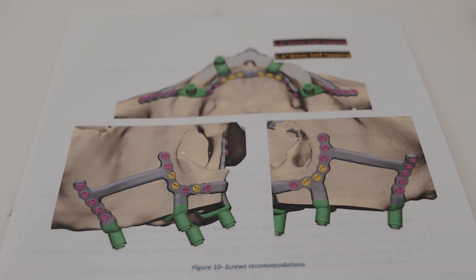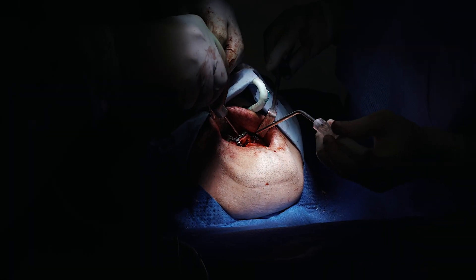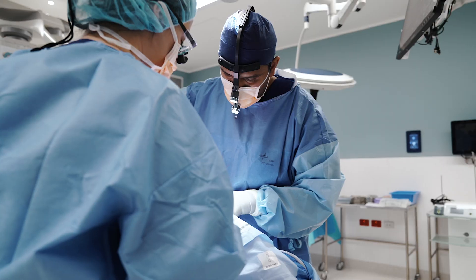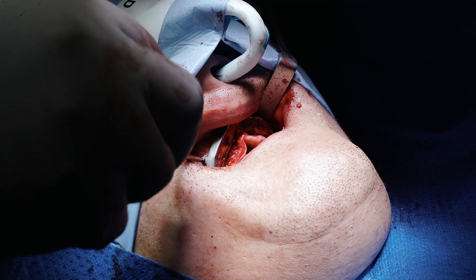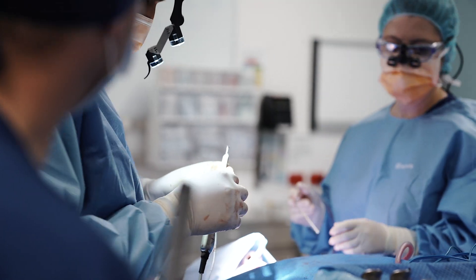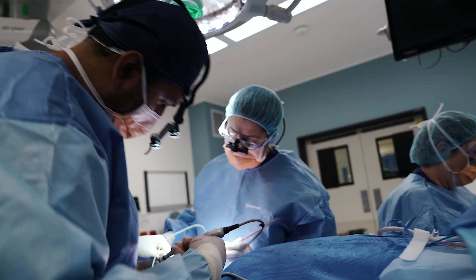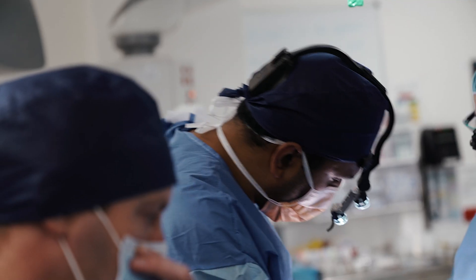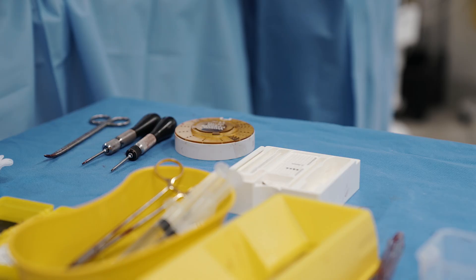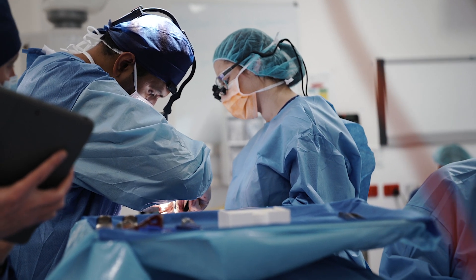After removing the alveolectomy guide, we insert the patient-specific subperiosteal implant. This is secured primarily to the zygomatico-maxillary buttress and also the naso-maxillary buttress using six and eight millimetre screw lengths. This can be achieved with the W&H straight S11 handpiece and also the W&H W75 handpiece to the palatal aspect of the maxilla. I try to place as many screws as possible, although the minimum number is 11 to 12 screws.